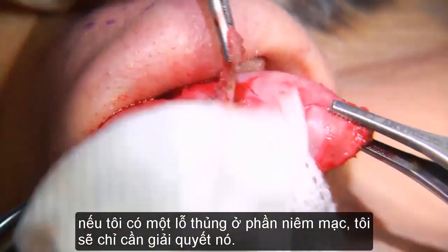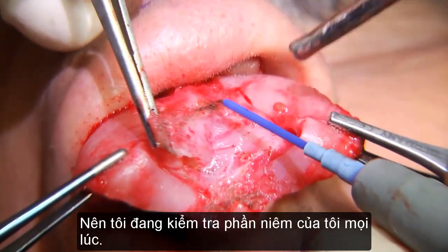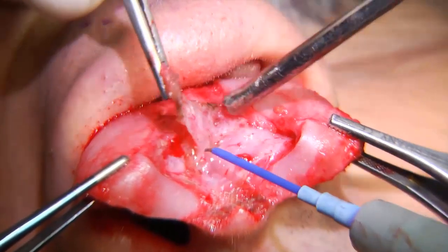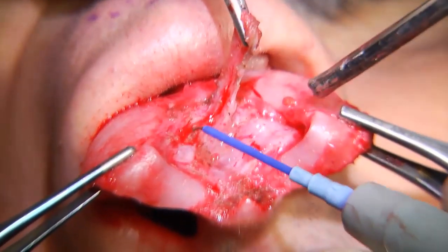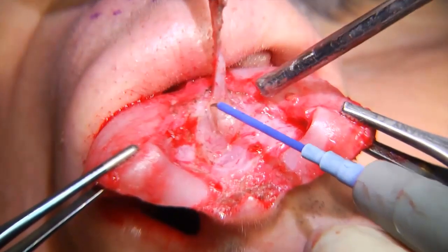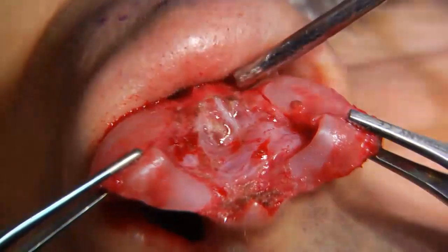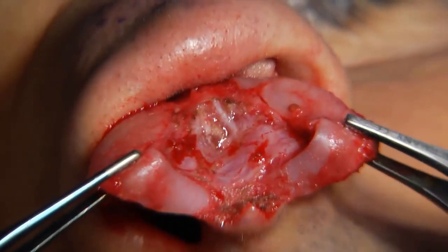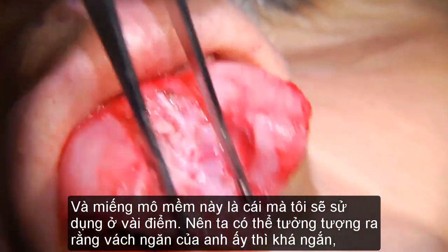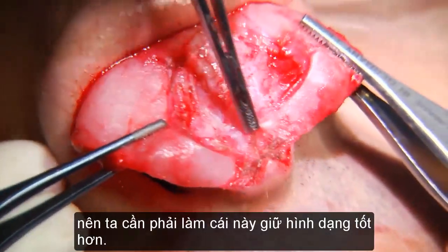So if I have a hole in the mucosa, I will just deal with it. So I'm checking my mucosa all the time. And this soft tissue is the one I will use for something at some point. So as imaginable, his septum is really short. So we have to get this thing in a better shape.